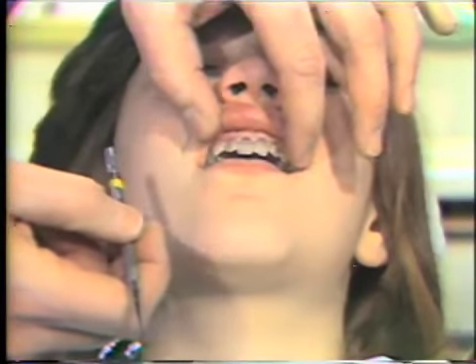The next thing we'd like to do is to look at a set of radiographs of these teeth. The purpose for the radiograph is to make sure that, again, there are no obvious defects in the teeth or that there's no periapical pathology.